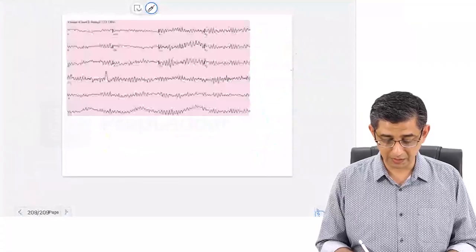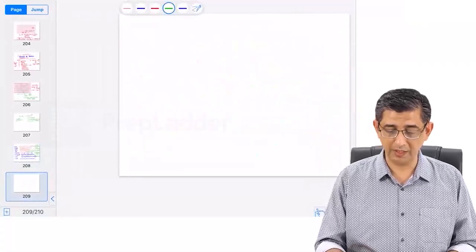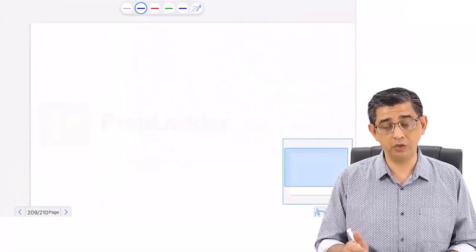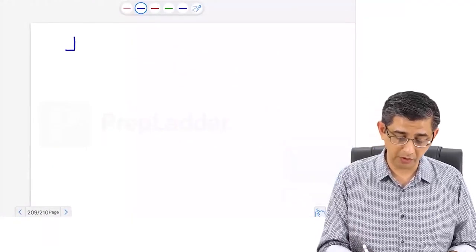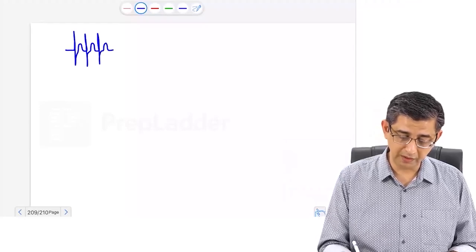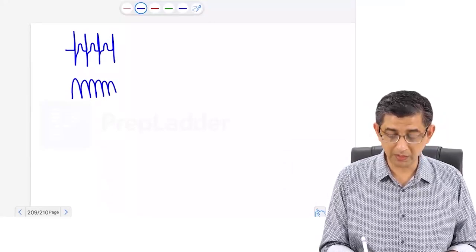So let's just make a summary here as well. And this summary will again help you realize the aspects with respect to QRS complex specifically. Abnormalities of the QRS complex is what I've highlighted. I have taught you regarding narrow QRS complex. This was PSVT as I highlighted. I've also taught you regarding situation causing a broad QRS complex.